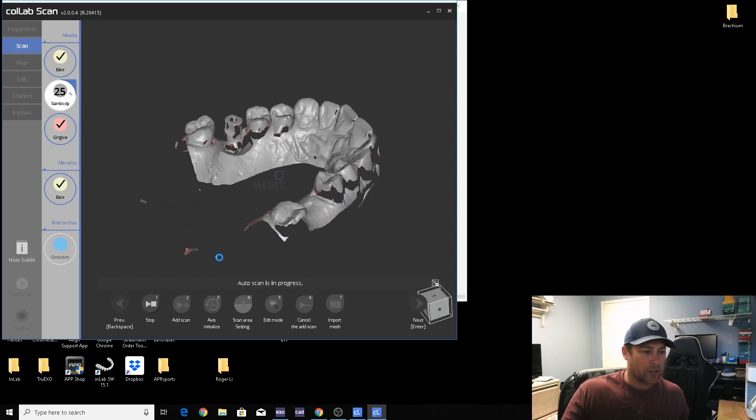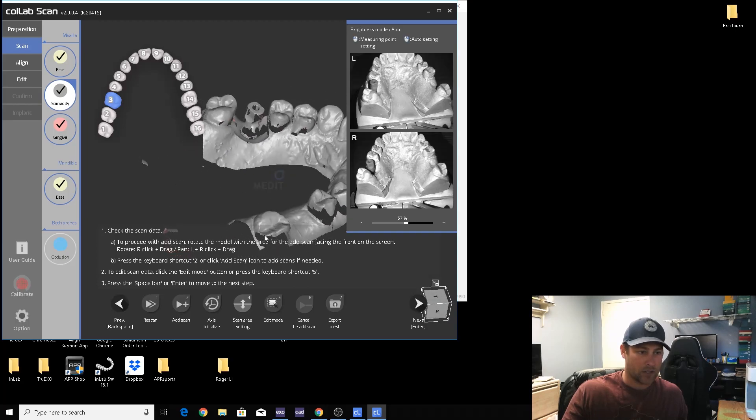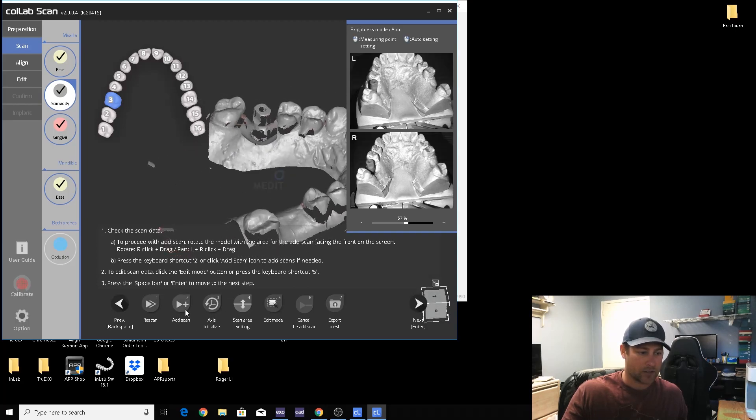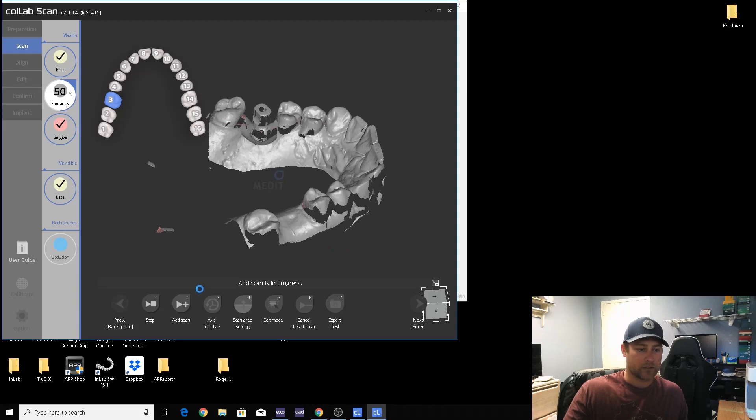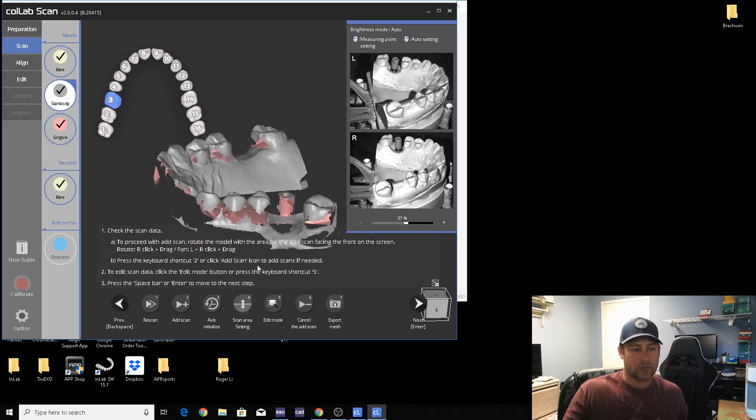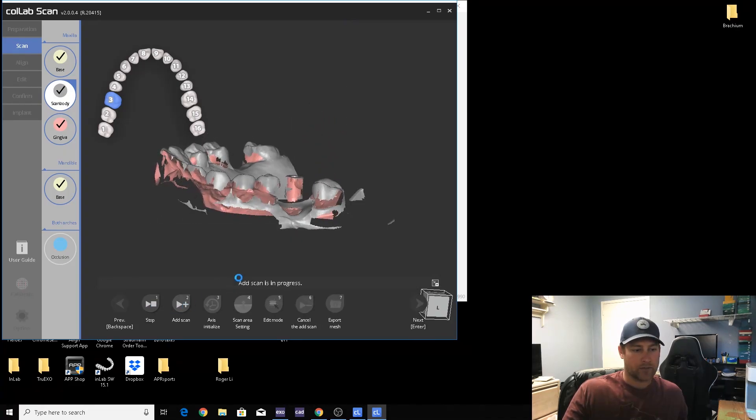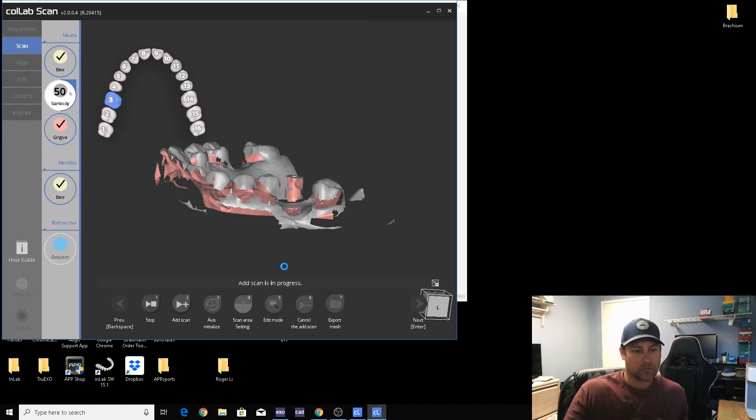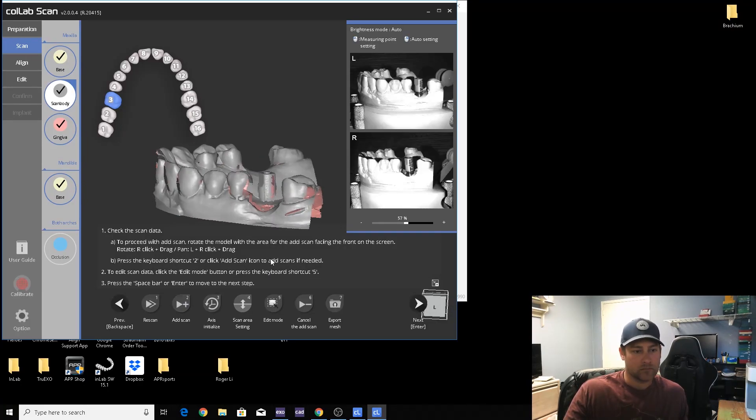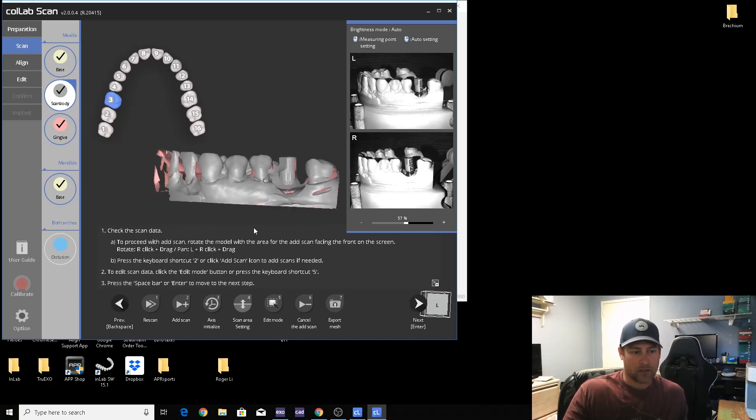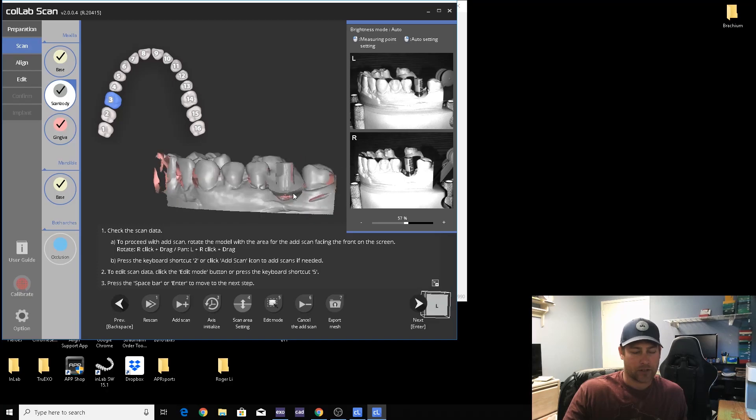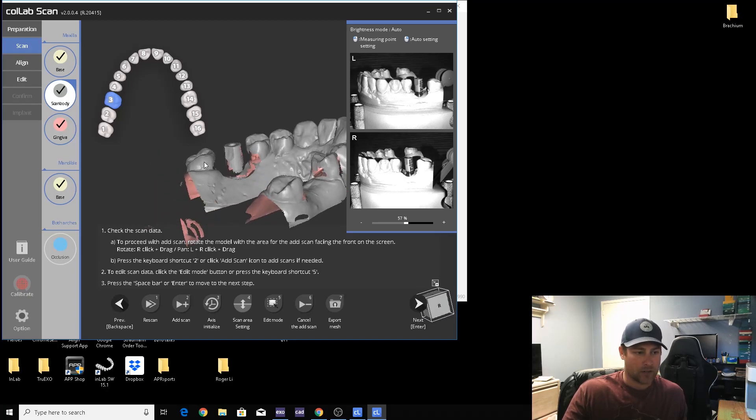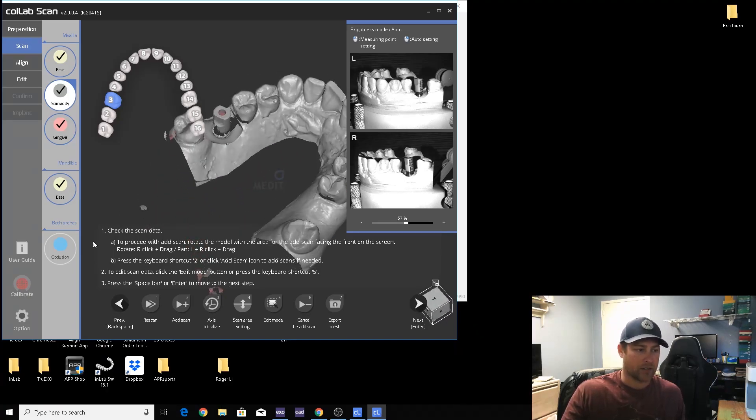This software does a ton of scans for the scan body, so it's not really necessary. If you want to speed it up, go ahead and just add your own in. Just stop it and then add scan, put that over here.